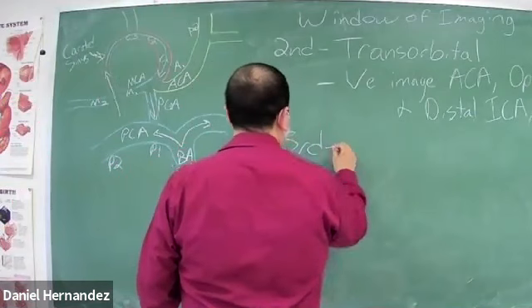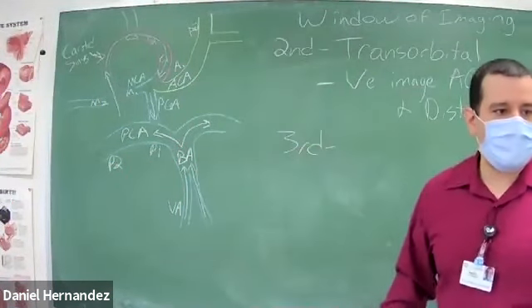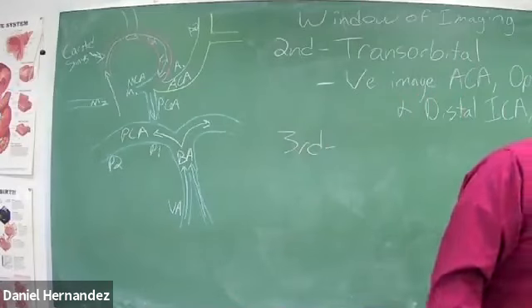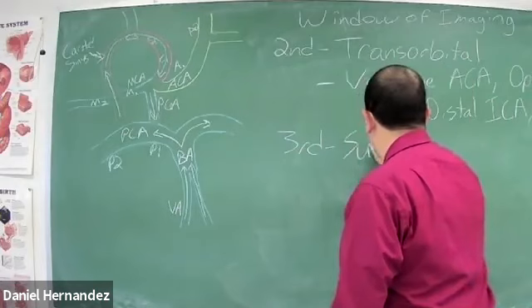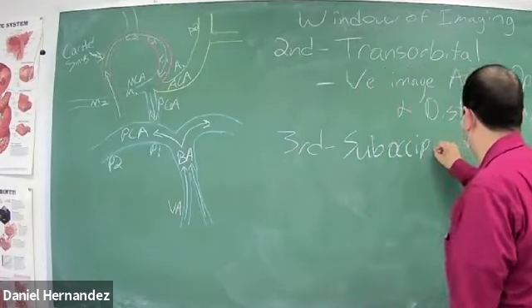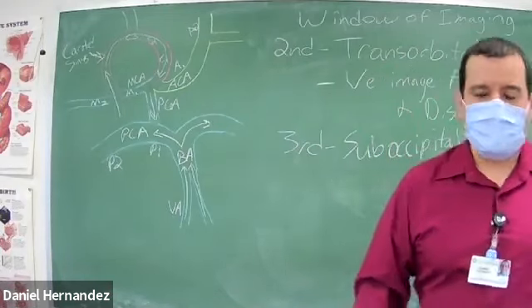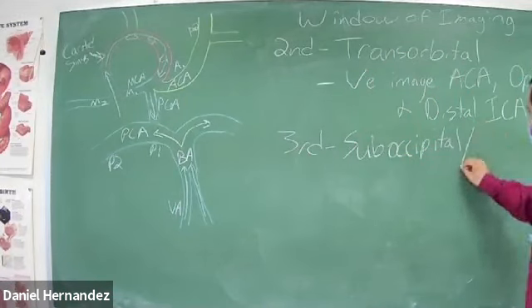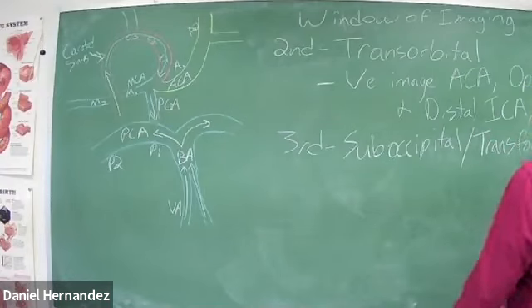The third window is called the suboccipital, or also the transforaminal.